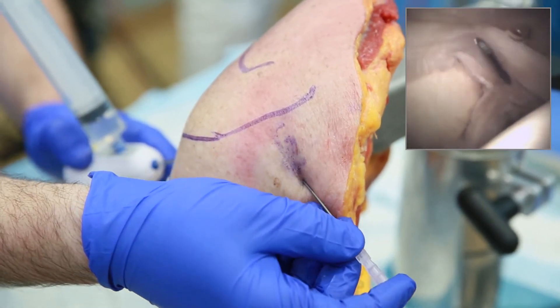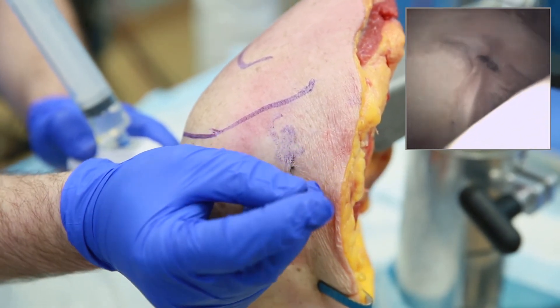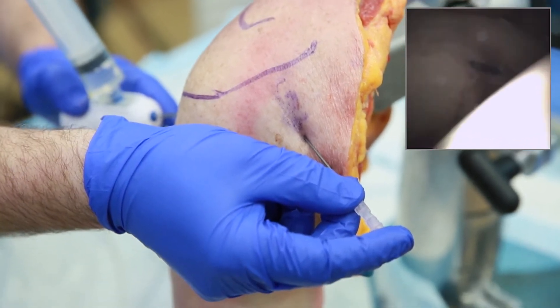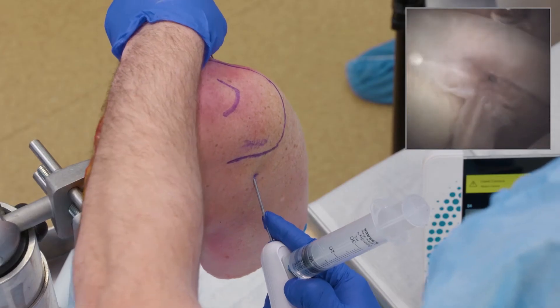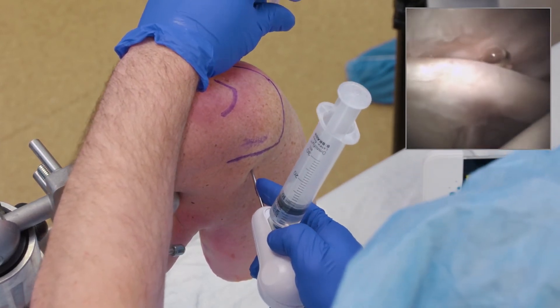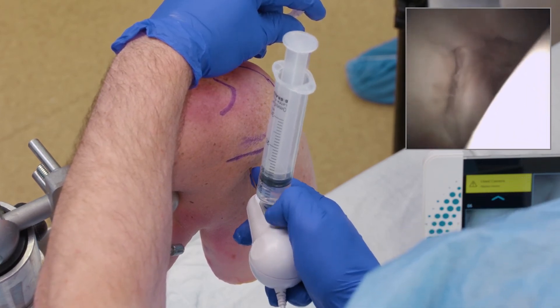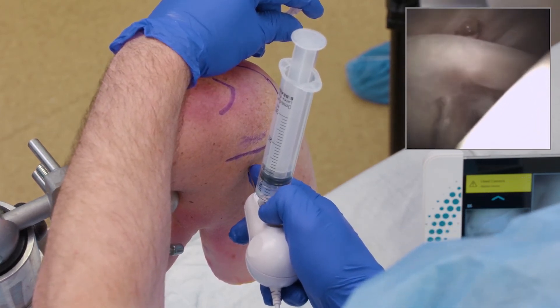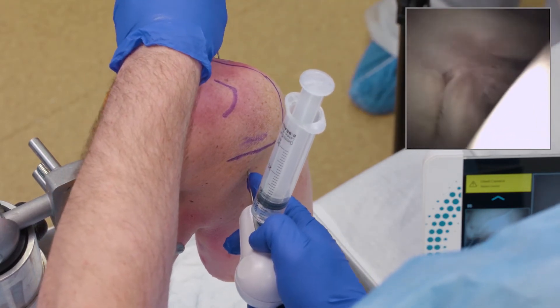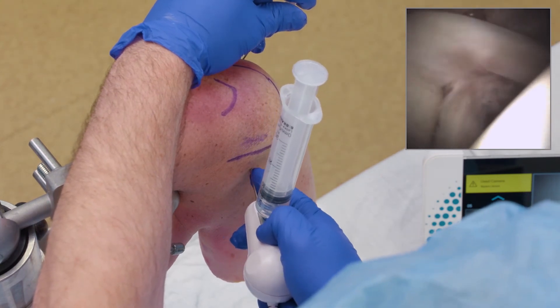I'll pull back — there's my biceps tendon. I can use my spinal needle to palpate and lift up and see: is this a SLAP tear that's degenerative or is there an acute component, by getting up underneath there and looking for scarring. I can pull my biceps down, bring it into the joint a little bit, and evaluate down the hiatus. I'll see some erythema on my biceps tendon which I wouldn't have seen when the biceps wasn't inside the joint. I can let that go and the erythema goes away.